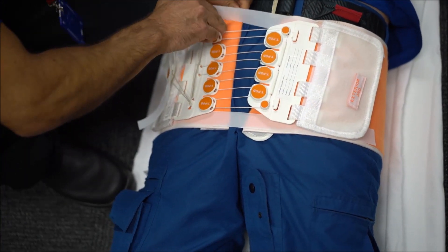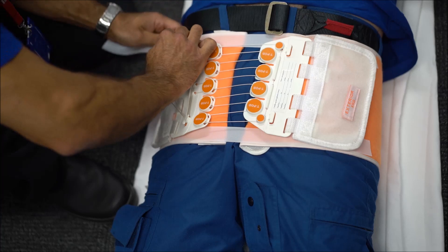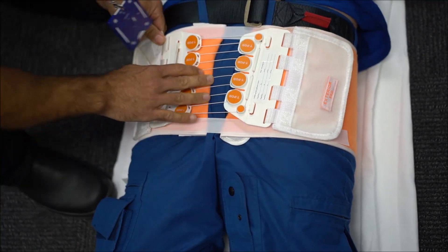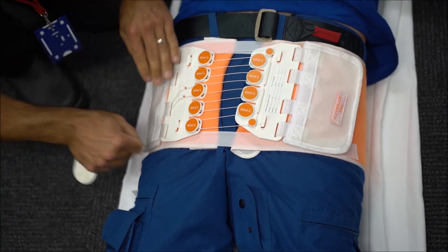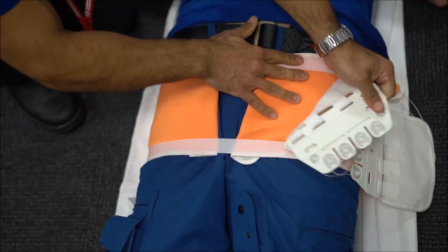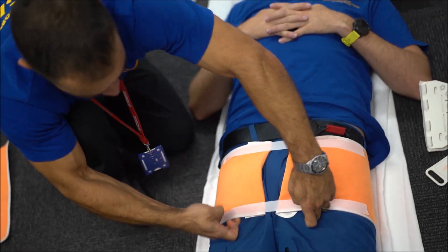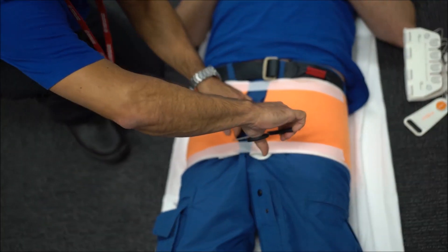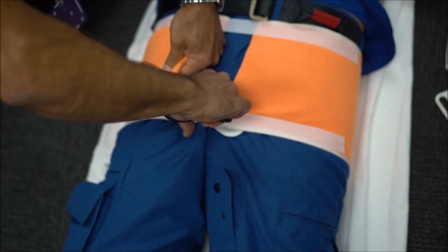An assistant might be useful to help with that. Once that's stuck to the orange fuzzy material of the binder, that will hold and not cause any undue release of tension, so that's still nice and snug as you can see, but it's possible now either to catheterise the patient or to use your trauma shears.